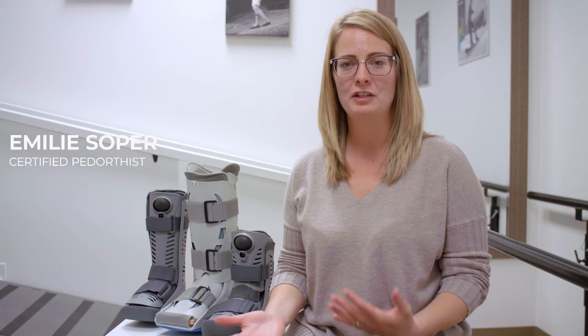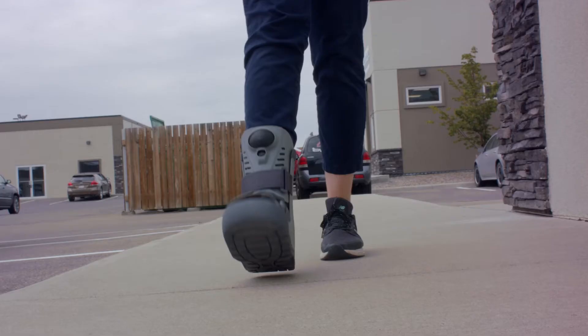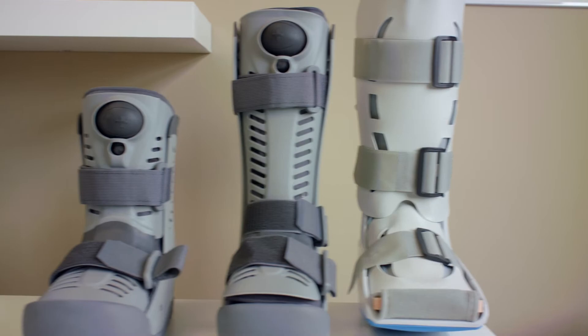I tore my plantar plate and have been prescribed an air boot. Whether you've been prescribed an air boot for fractures, sprains, or whatever it may be, I'm just going to show you the differences and how to put it on.